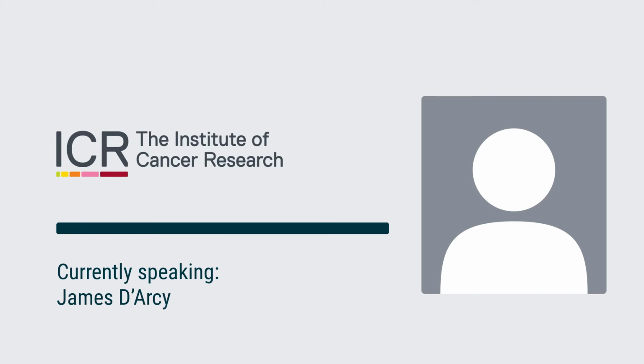I think one of the issues is that orientation information is not mandatory, and one of the issues that we face in developing these viewers is that it's fine if you happen to get conforming data that comes in and you'll be able to display it, but if you can't guarantee that will always be the case, then you face problems. Sorry, James, I interrupted. No, that's fine.